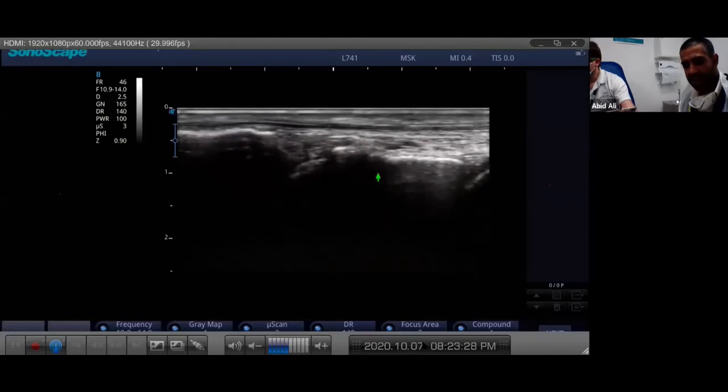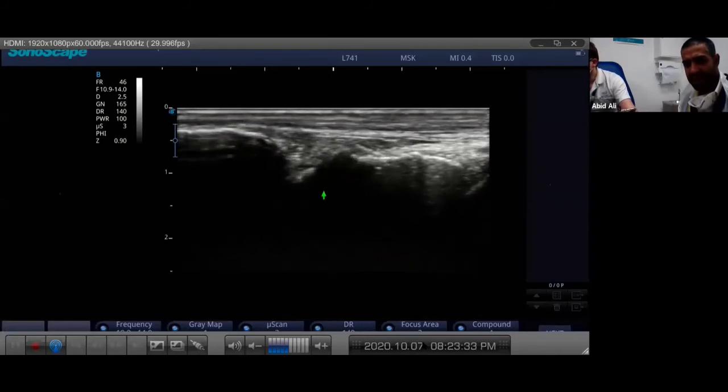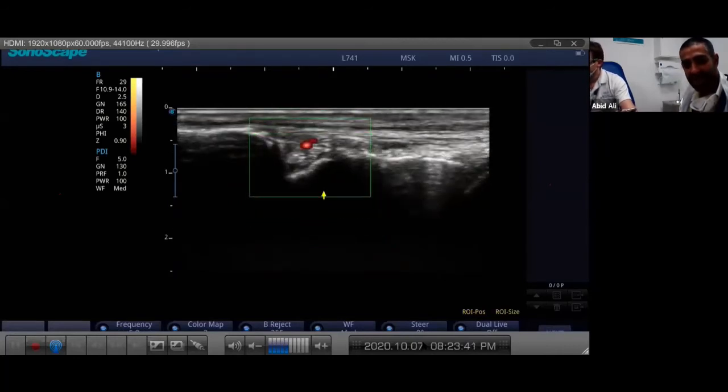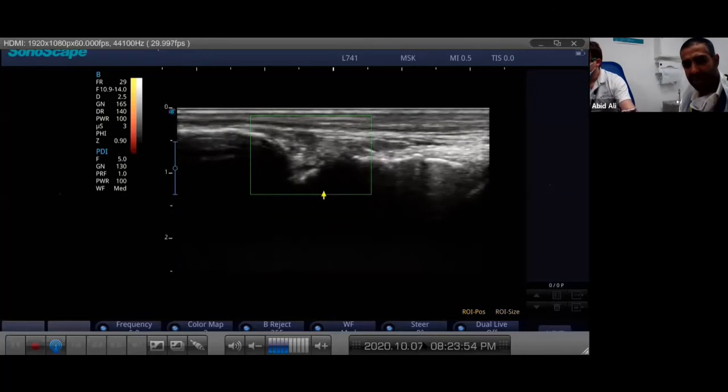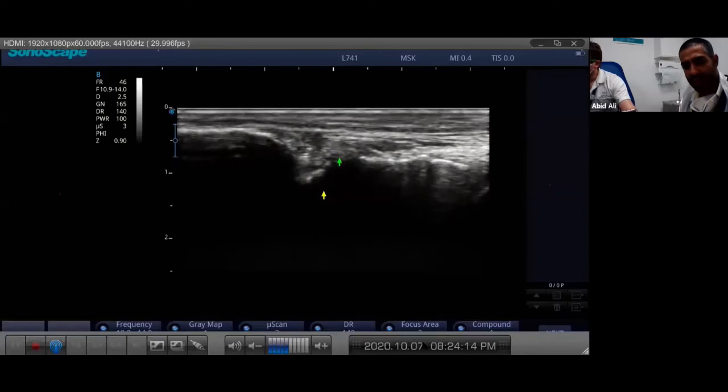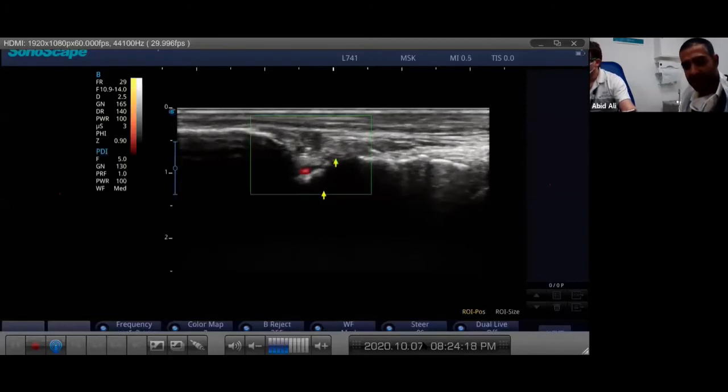This is the cuneiform joint - even look at this, it looks a bit mushy in there - that's my technical terminology. It doesn't look nice and clean, you can't see nice clean lines. There are some erosions around the edges and periphery, some little osteophytes, a little bit of calcific deposits we can pick up. You can see these little white flecks just appearing as I move my probe gently. There's a cloud of white mushy stuff - possibly synovitic changes.